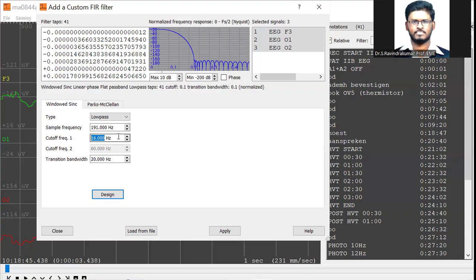So now we measure the motor functions for Parkinson's disease. For dyslexia, we will be measuring the cognitive skills. So that makes the difference. According to the patient and the disease, we are able to select which signal we are going to analyze, whether we are going to analyze the cognitive functions of the patient, or whether we are going to analyze the motor functions of the patient.